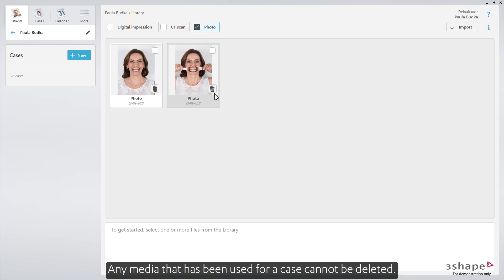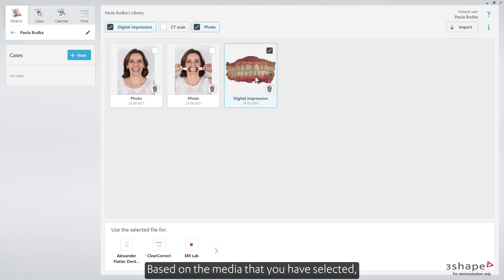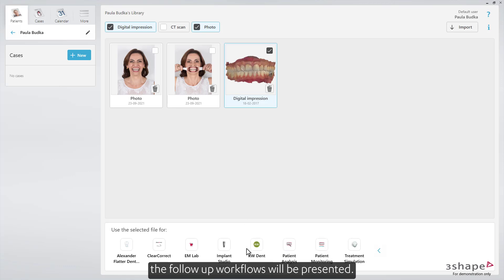Any media that has been used for a case cannot be deleted. Based on the media that you have selected, the follow-up workflows will be presented.